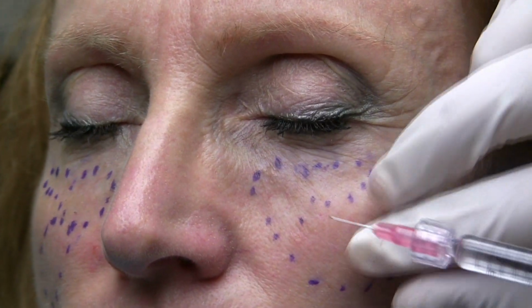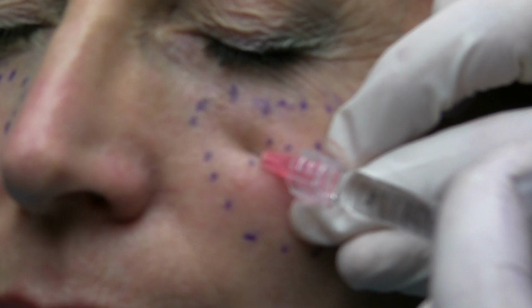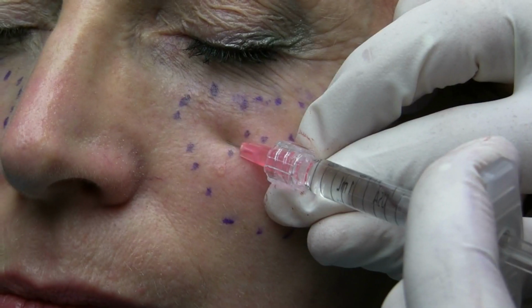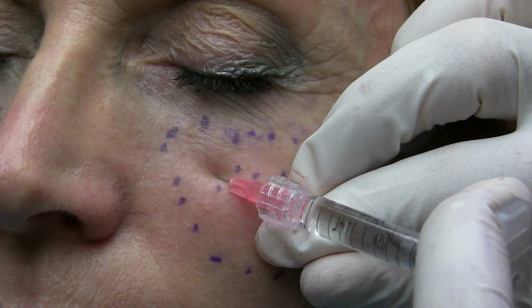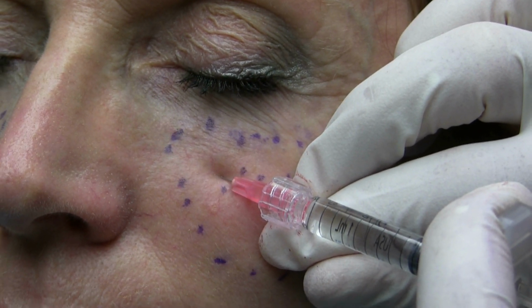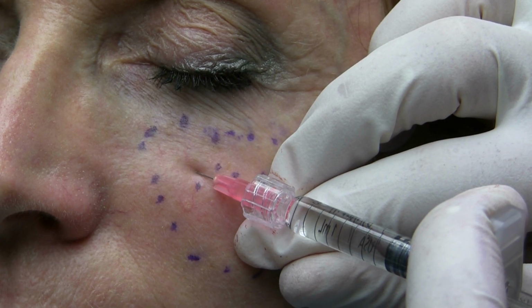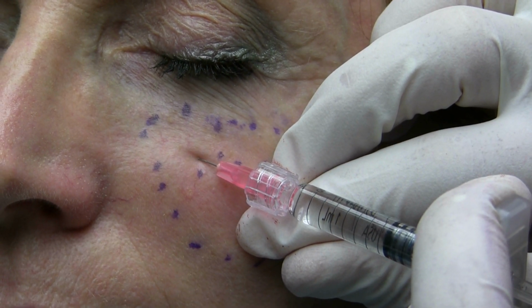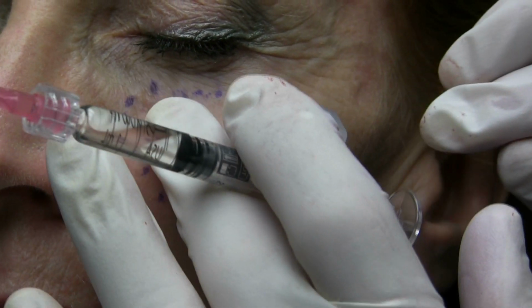Switch to the infraorbital anterior trough region, and we've done an infraorbital block. Is that uncomfortable? A little. Okay. And when we're injecting periorbitally, you want to use very little syringe pressure. And you want to really inject slowly. And I like to inject as I am coming out, because you want to avoid intravascular injection.